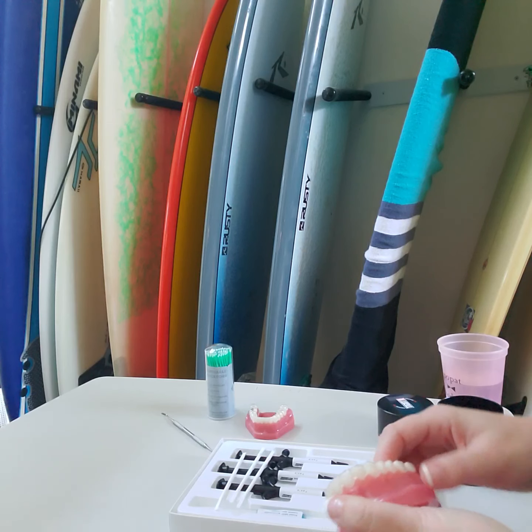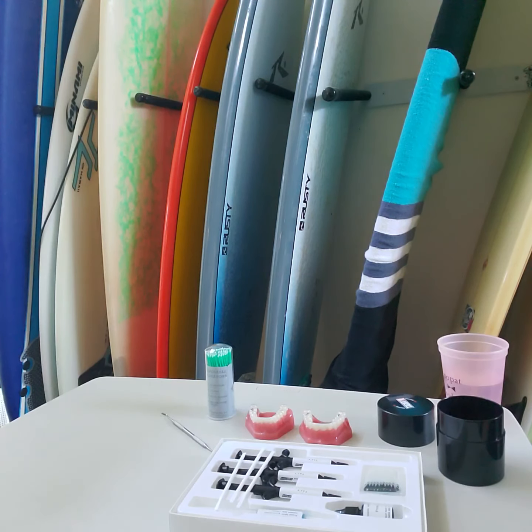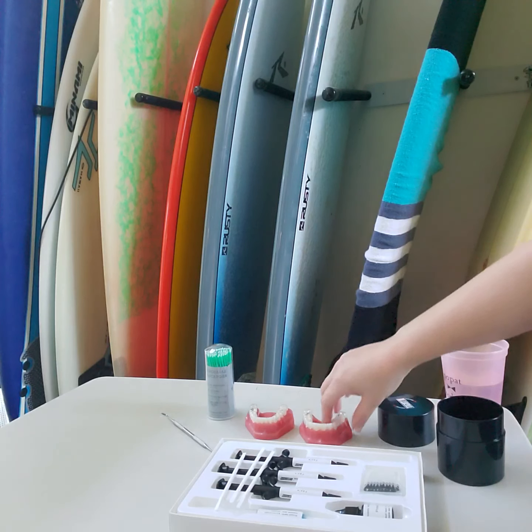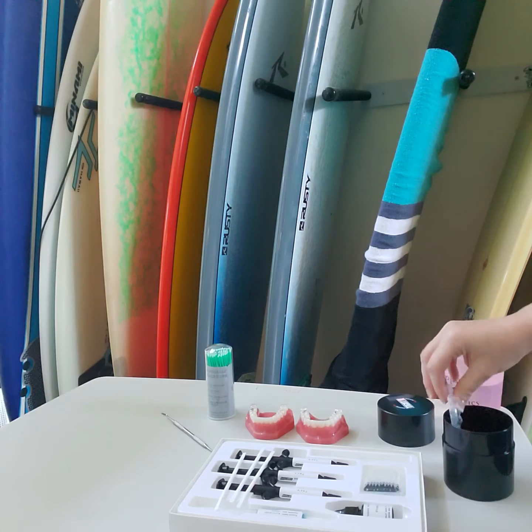They're not that hard. So basically, you'll get a separate tray for that. It will be the first tray. Sometimes they write attachments on it, and with some other aligner companies, it might just say zero tray. It's usually a thinner tray because it's easier to peel off. I like to prep my trays ahead of time, and this is what I'm here to talk to you about.